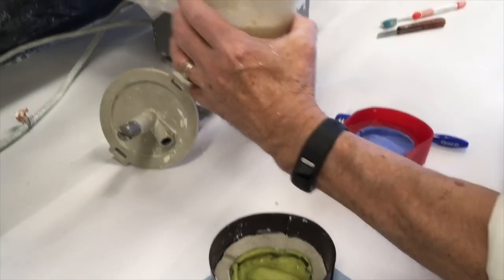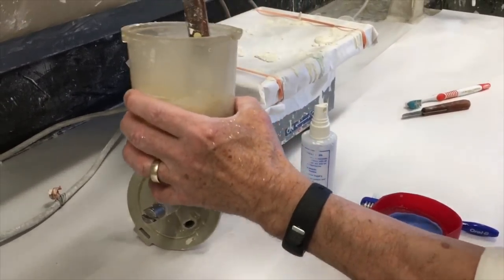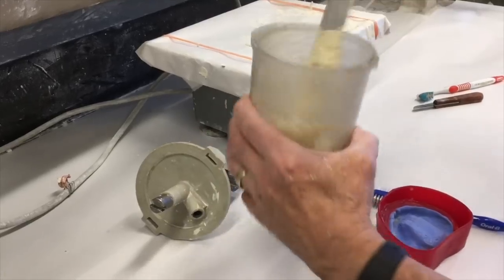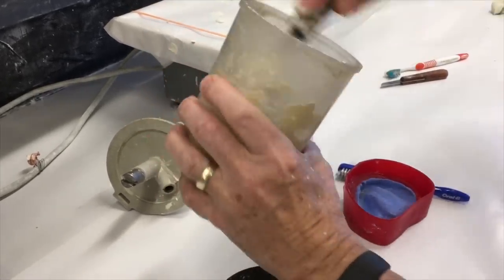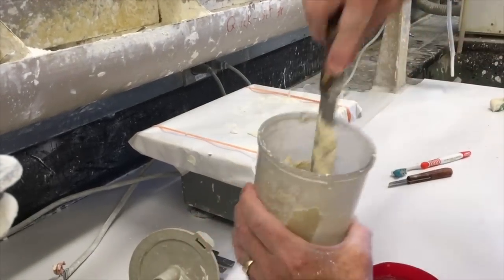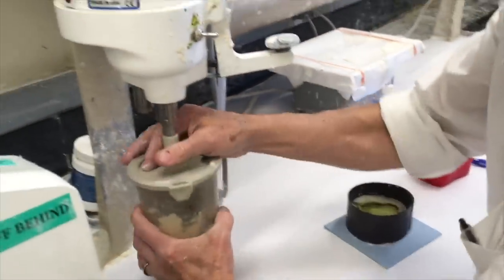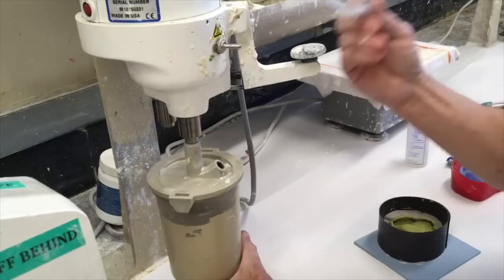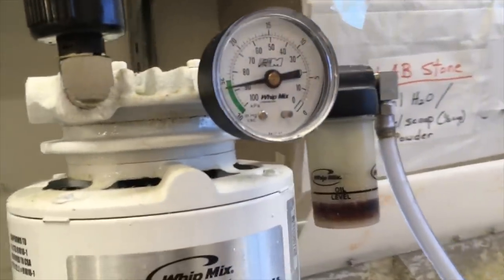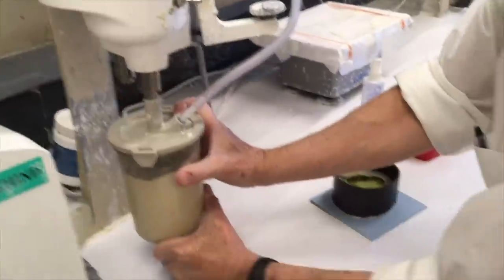Remember that the thicker your mix is, the stronger the stone is. If you're not sure of that, then measure out your powder. I want a consistency that's at least thick enough that it's not going to fall off the spatula — all the powder fully saturated. Get it away from the edge, make sure the gasket's clean, and the hose goes in last. You should be able to see it go up to about 25 pounds. It started out about 12, so we're netting about 14 pounds.